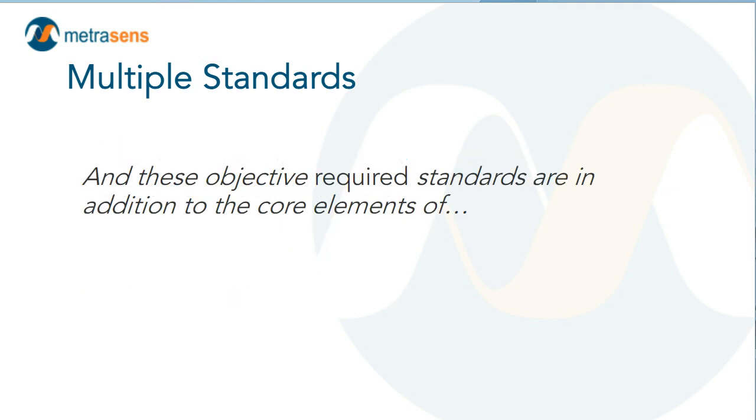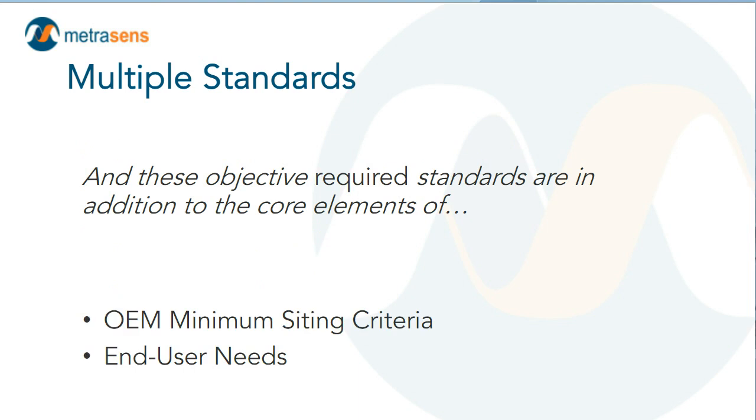All of these external standards that I mentioned are in addition to basic minimum siting guidance from your OEM, your original equipment manufacturer, as well as the end user needs. What I would suggest is you really want to start with the last thing I have put on this list. You want to start with the end user needs, the expectation of how this facility is going to operate when all is said and done, after ribbon cutting day.